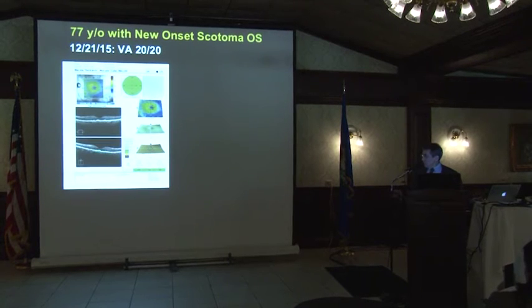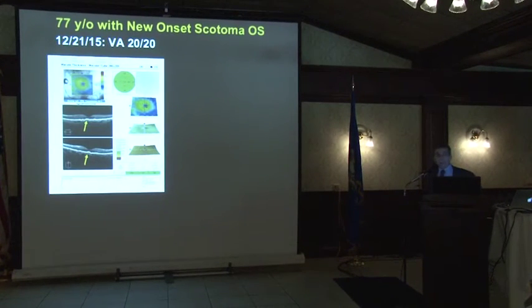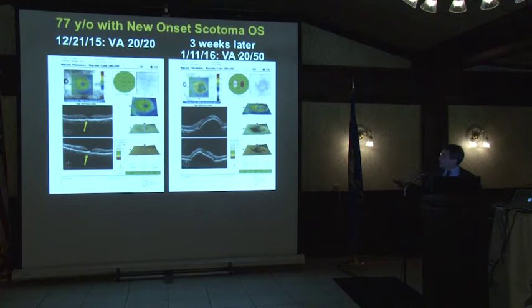Looks like typical drusen, right? Nothing too concerning. Watch, Amsler grid, monitor your vision. Patient comes in 3 weeks later, look at that. The vision's still pretty good, but do you think this blood vessel just popped up suddenly?